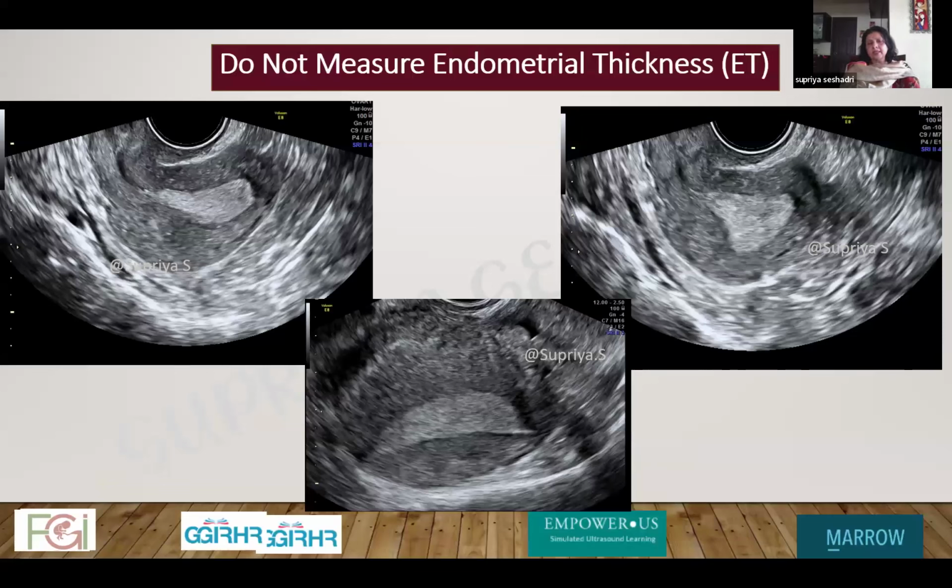How do I recognize a normal endometrium in a sagittal plane? It will be leaf-like, whereas if we get a triangular-shaped endometrium, then that indicates that it is a coronal plane, and that is not standard. So my first message here is, anytime we see a report saying thickened endometrium, please look at the image. There should be images accompanying every report. That need not be emphasized enough.